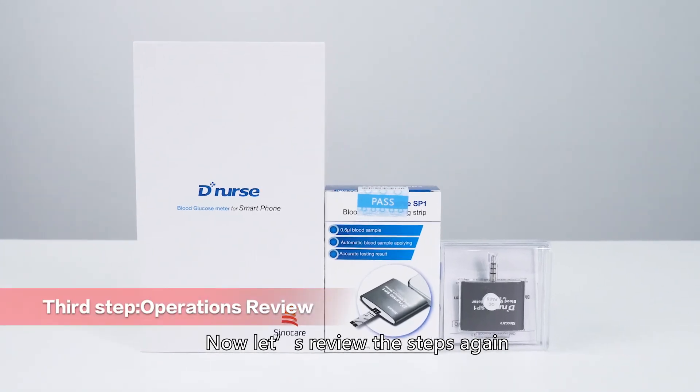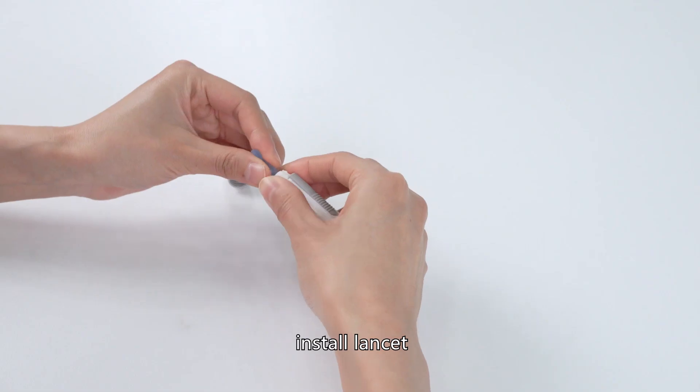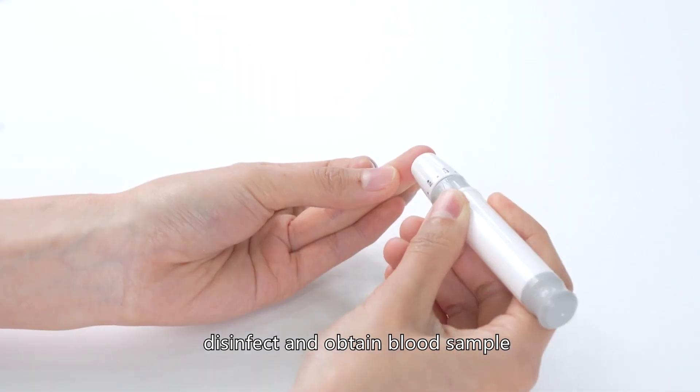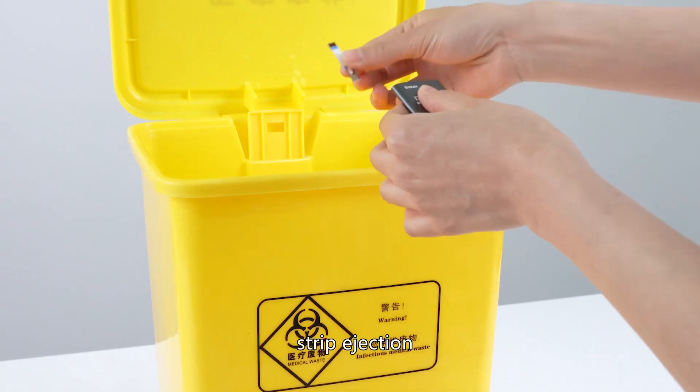Now let's review the steps again: Prepare app and equipment. Install lancet. Insert strip and set the device. Disinfect and obtain blood sample. Apply the blood sample. Strip ejection.